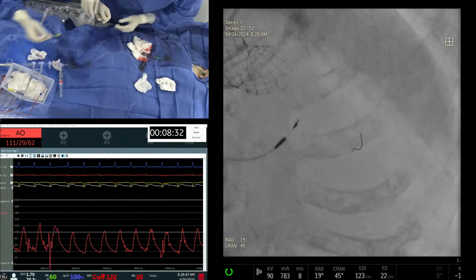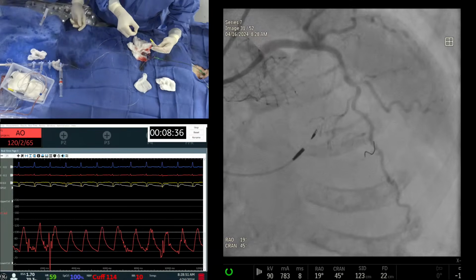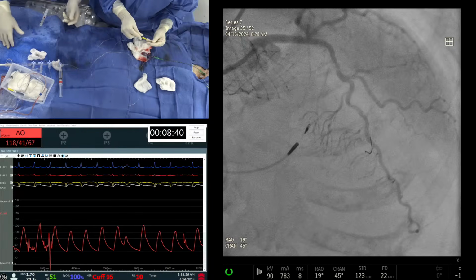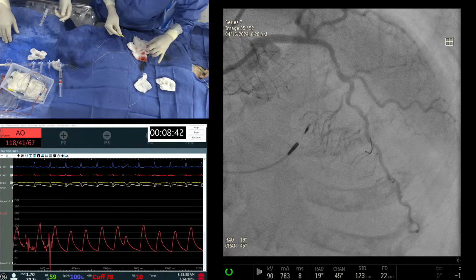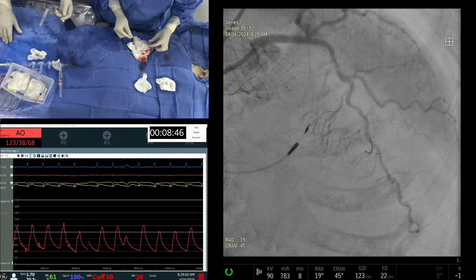Yeah. All right, so far so good. I would say it has shaved a little bit off one side. You see the haziness has become less. Let me know if that is corrected now. The flow is very nice in the LAD.